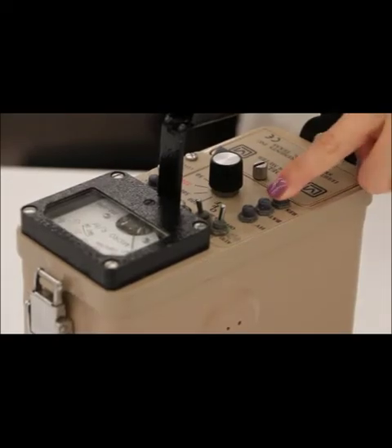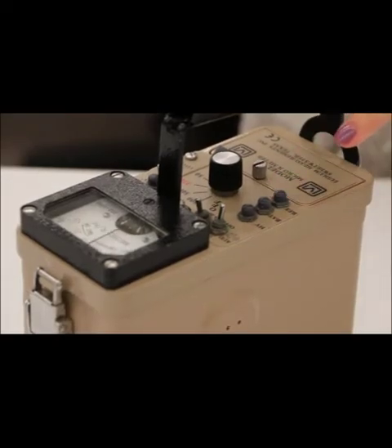The reset button is used to provide a means to drive the needle back to zero on the display. This is useful if the meter has gone full scale and you move to a higher range position.